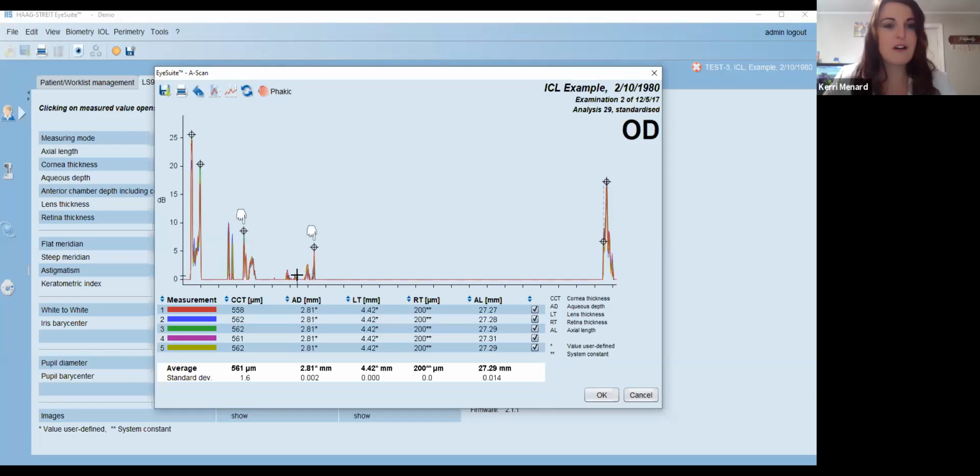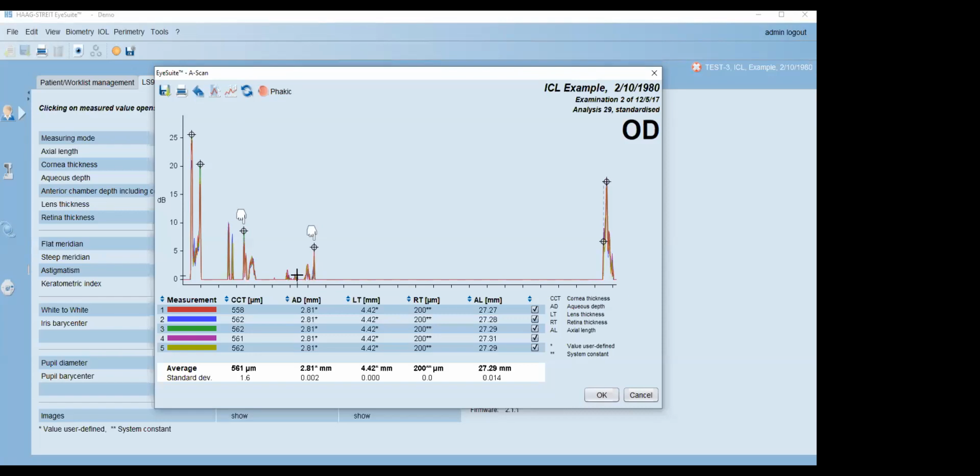If there are no caution markers on the IOL calculation sheet, is there still a need to review the biometry readings? The only thing that I would look at, I would do a bilateral comparison just to be sure that everything makes sense, and check the standard deviations, because there's no internal flag as of yet on high standard deviations for axial length in case.